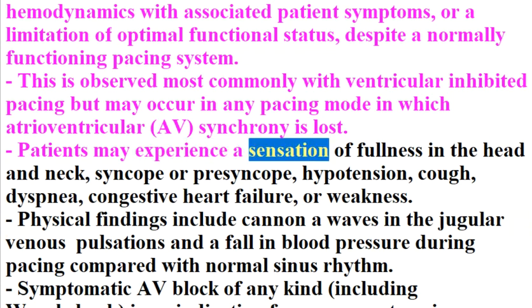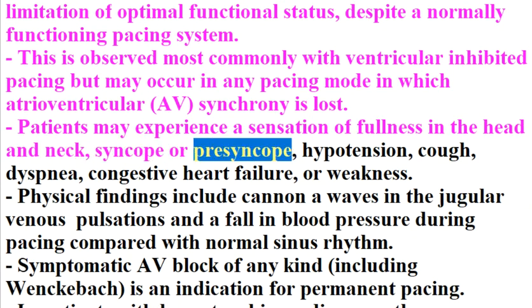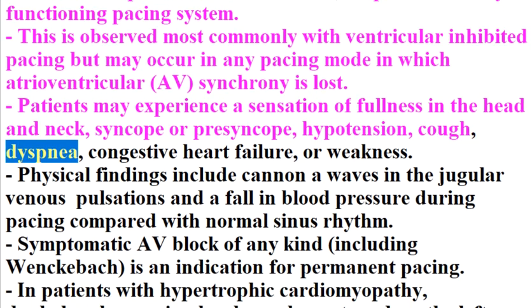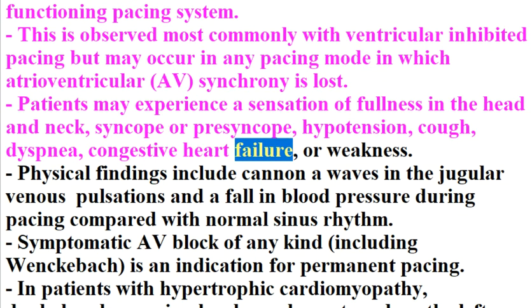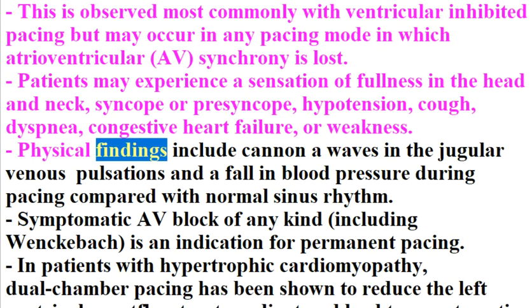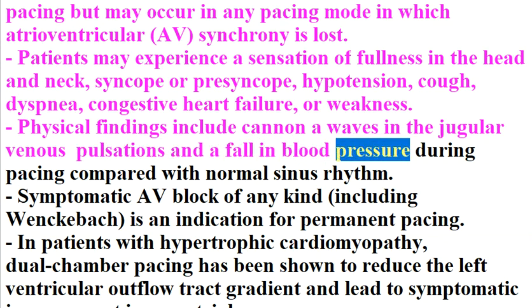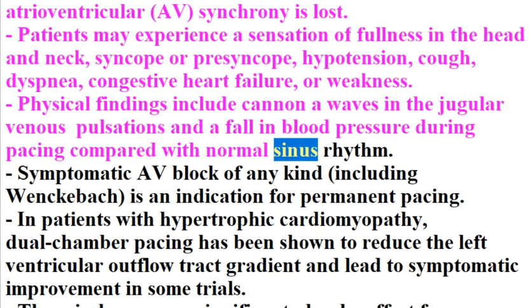Patients may experience a sensation of fullness in the head and neck, syncope or presyncope, hypotension, cough, dyspnea, congestive heart failure, or weakness. Physical findings include cannon waves in the jugular venous pulsations and a fall in blood pressure during pacing compared with normal sinus rhythm.